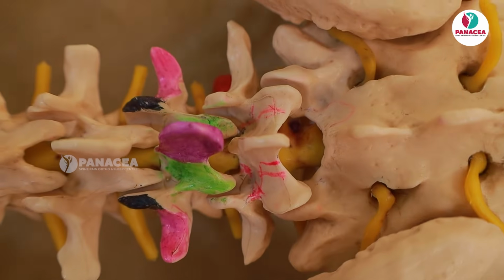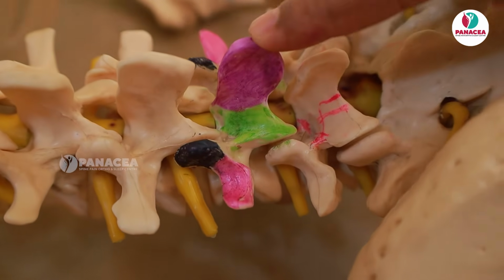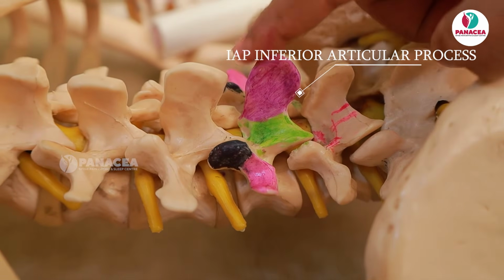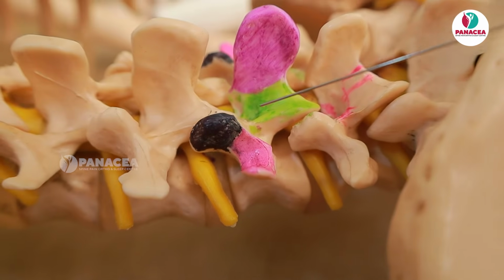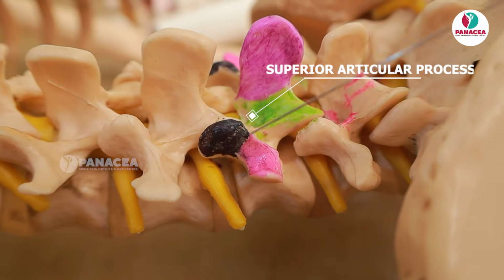But as you move oblique 30 degrees, the spinous process gets aligned. This is the SAP, this is the IAP. You get a Scottish dog appearance.